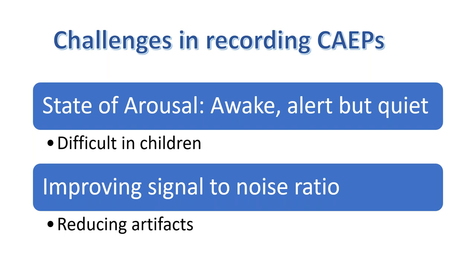So what are the challenges we have while recording cortical evoked potentials? We all know that cortical evoked potentials are affected by sleep. It's not that it is totally absent when a person is sleeping. We have recorded cortical evoked potentials in sleeping children also, but the amplitude is reduced. So when the amplitude is reduced, if a response is present, I can go by it. If a response is absent, then it is difficult for me to say whether it is the sleep which is affecting the response, or whether the child does not have a response.